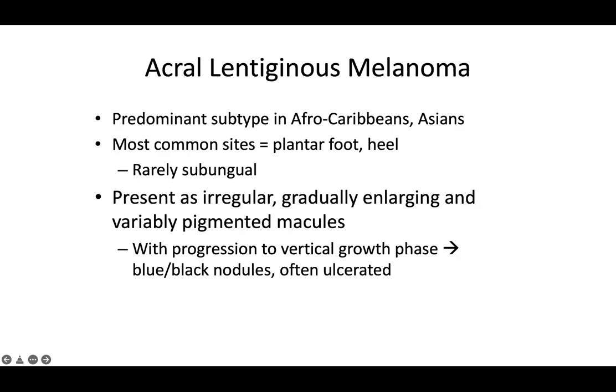When you're looking on dermoscopy, you'll want to see if you have prominent involvement of the ridges as well as the furrows, but even the ridges, that can signal to you that you'll probably need to do a biopsy because you can have atypical melanocytes that are more on the superior aspect of the dermal papilla, the ridge there.